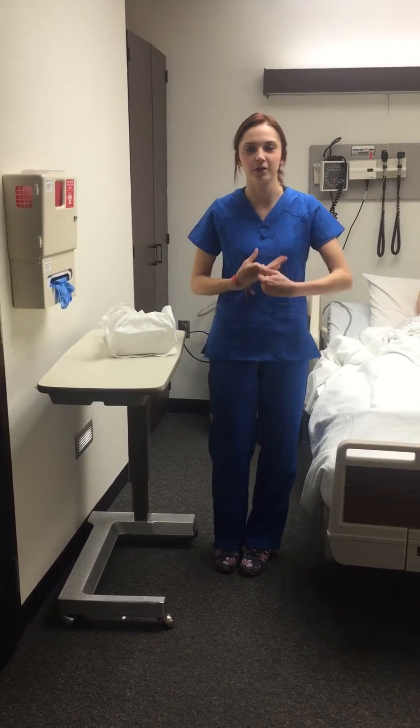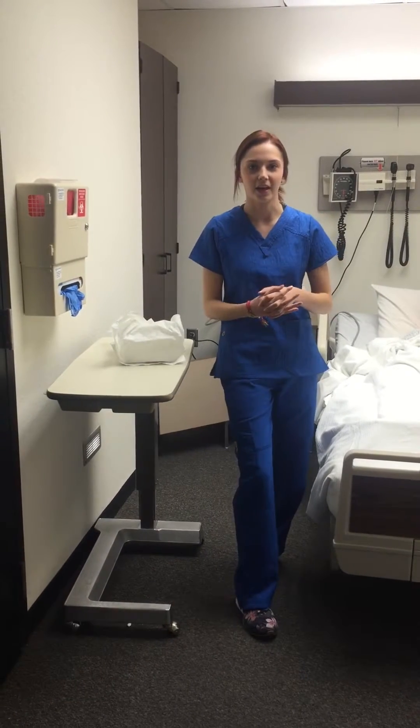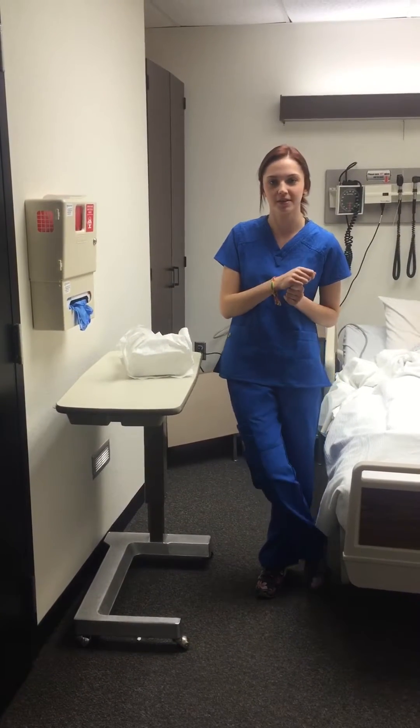I'm Maya Jurdie and I will be doing catheter insertion. I have gotten orders to put in a catheter and I have now come in the room and identified myself.